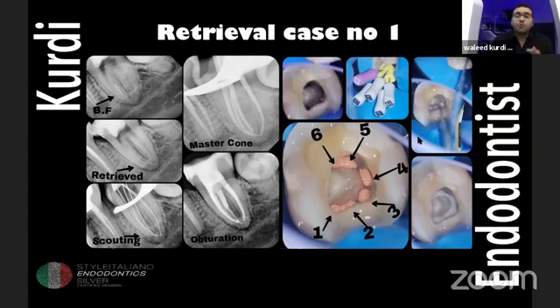I used to use the E25 tip, or the ultrasonic tip, to retrieve my broken files.